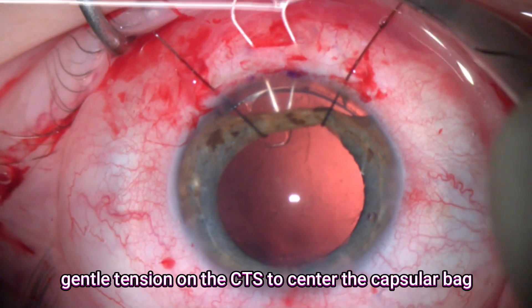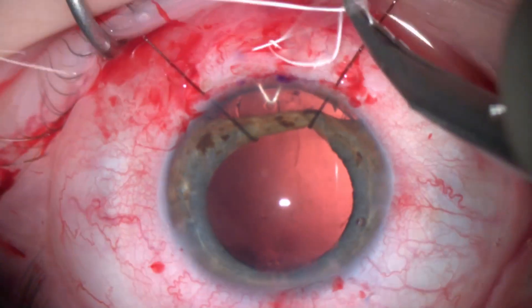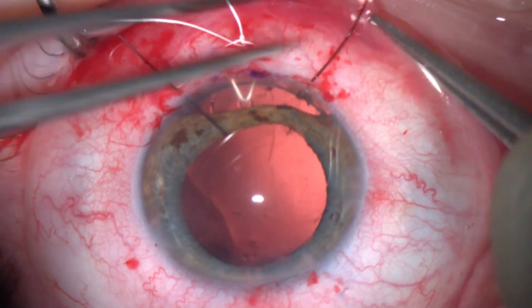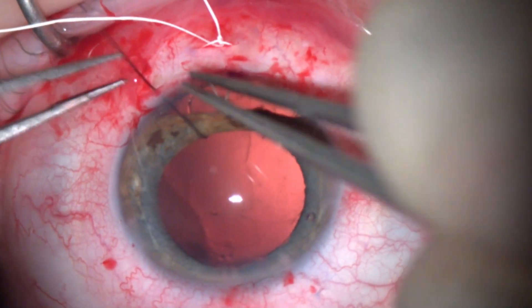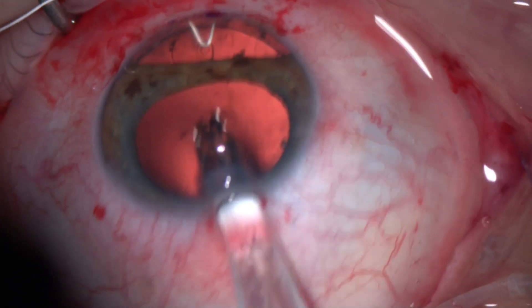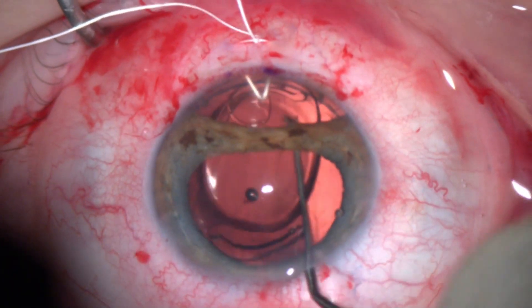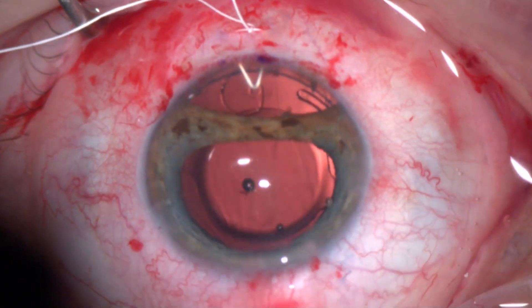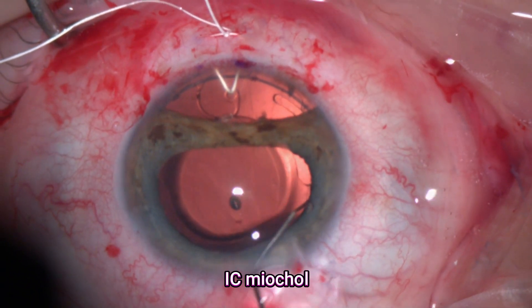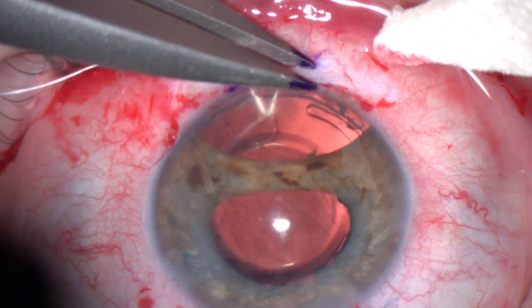I'll put initially just a gentle tension just to keep it secure in place, and you can notice that the capsular complex is now well centered in the pupillary axis. Then I'll remove the iris hooks and put the lens implant within the capsular bag. The lens is now nicely centered, and I'll put some extra miotic to constrict the pupil.